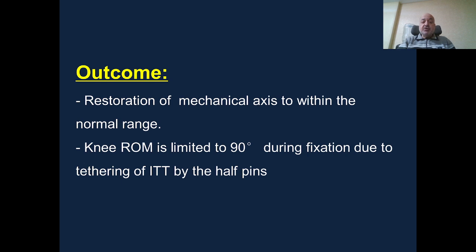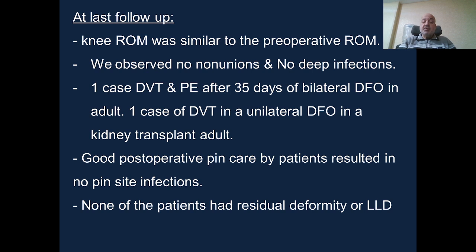The knee range of motion is limited during fixation to 90 degrees due to tethering of the iliotibial tract by the half pins. However, it was restored after removal of the frame and intensive physiotherapy. At follow-up, the knee range of motion was similar to the pre-operative range of motion. We observed no cases of non-union and no deep infection.